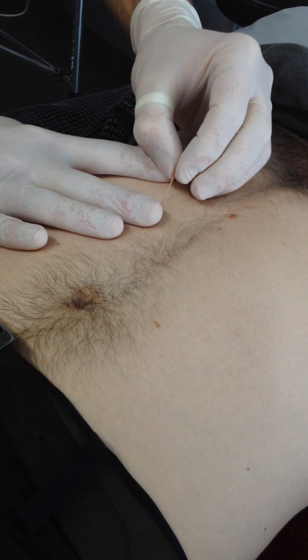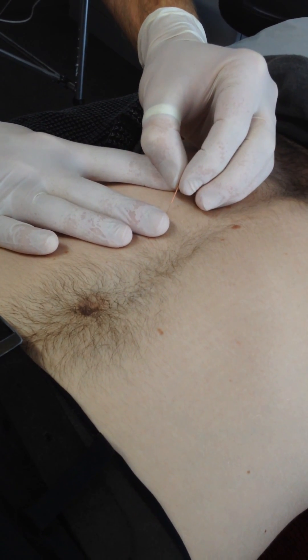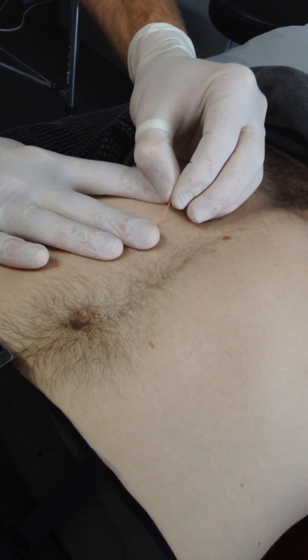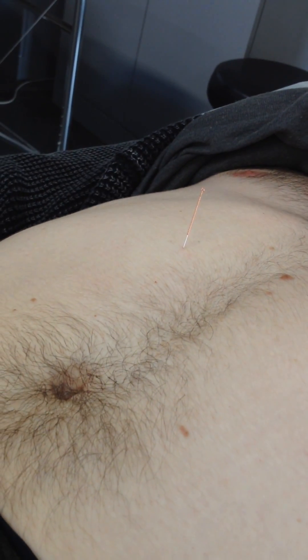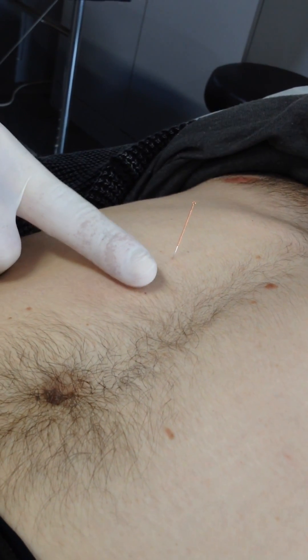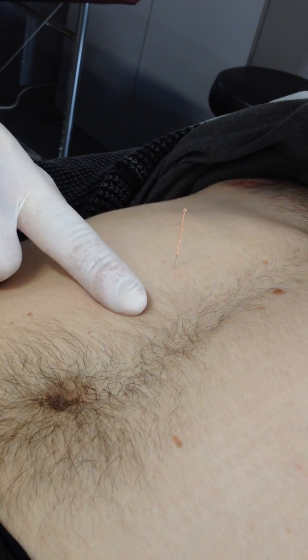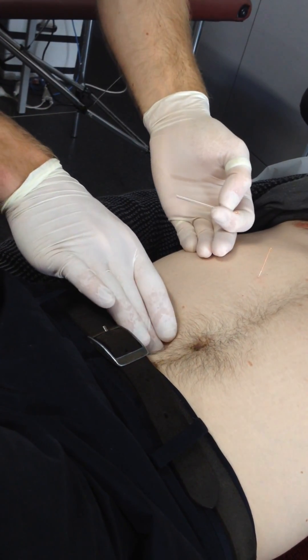I'll just pass through that tissue, and I'm already just hitting that abdominal fascia of the muscle. Sitting in that there — you'll find that as I pull that, if it wasn't in the fascia of the muscle, the needle would likely move with the skin. See how it's not, because the tip is stuck. So obviously we've passed through just into that fascia there.